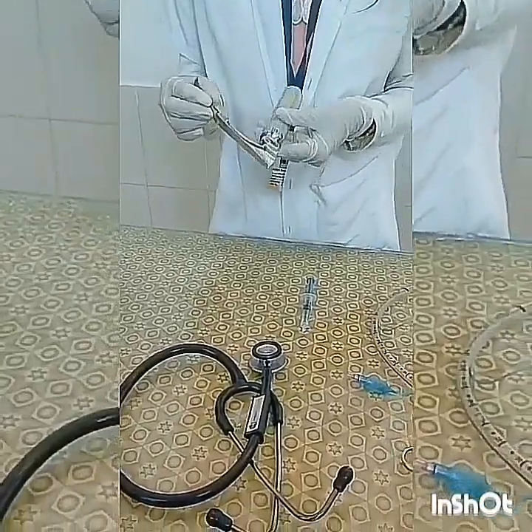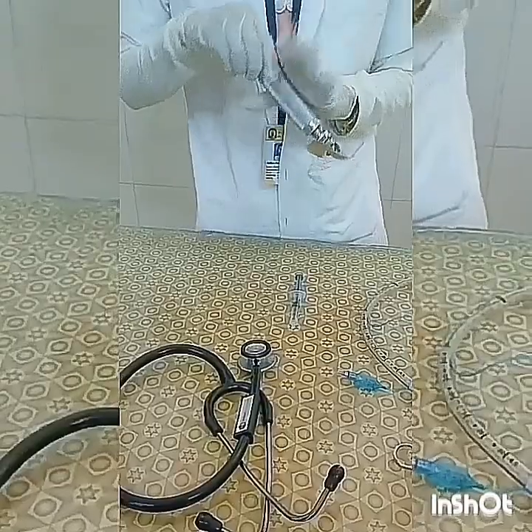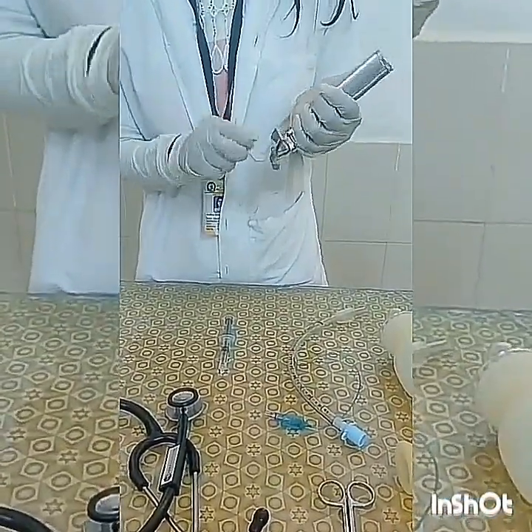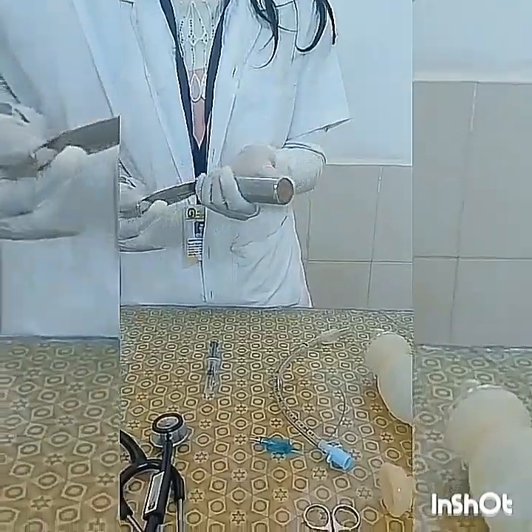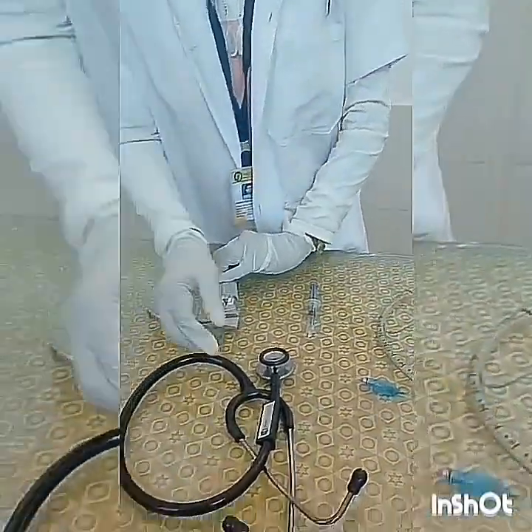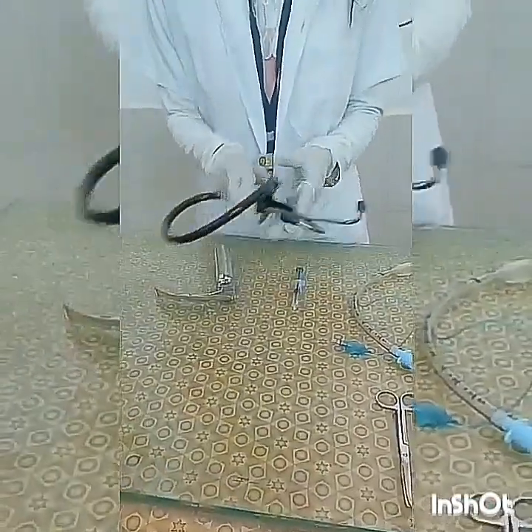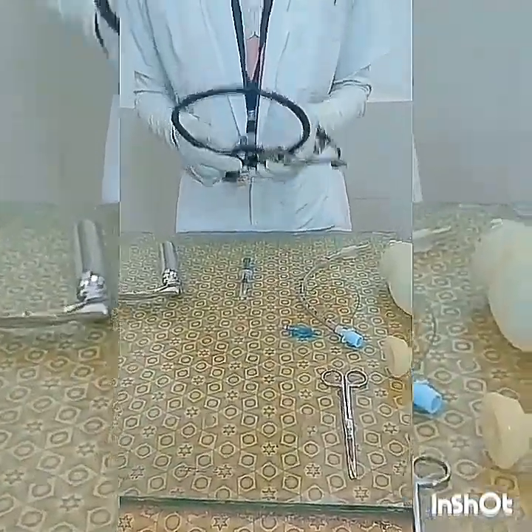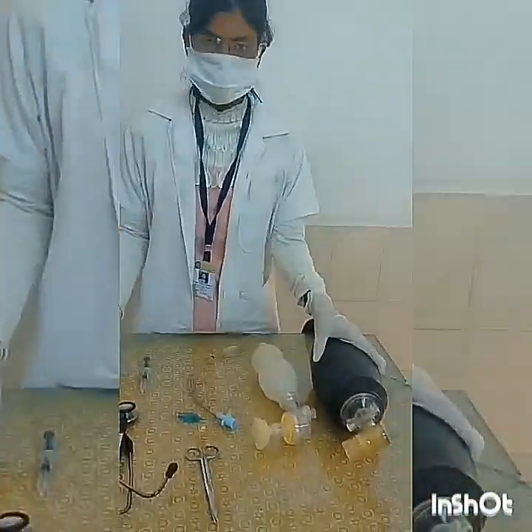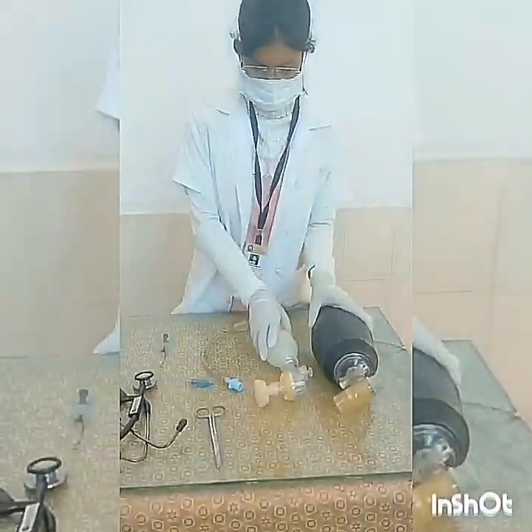Now this is the most important instrument, that is the laryngoscope. It is a metal device with a light source. Hold it like this. It has two parts, blade and handle. The handle has a rough surface for better grip. Now the stethoscope for hearing lung sounds and heart sounds. In this way all instruments are kept ready during the ET process.